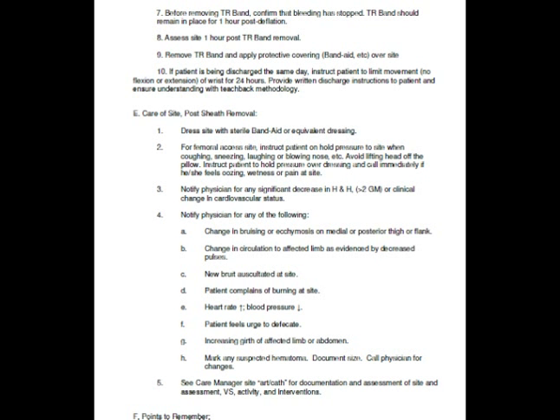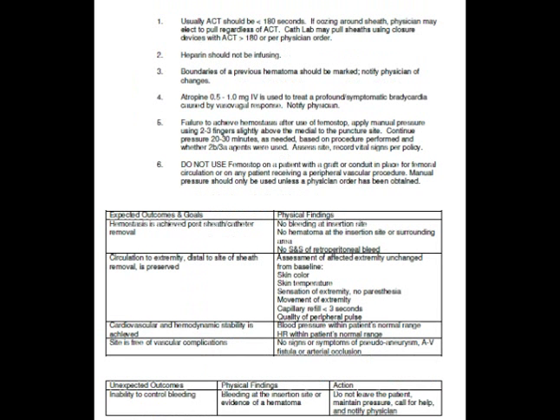So they also in this policy have care of the site, what you would do. You could use a sterile Band-Aid or equivalent dressing. I find most people like to use the Tegaderm and the BioPatch. Notify the physician of a significant decrease in hematocrit or hemoglobin, or clinical changes in their cardiovascular status.